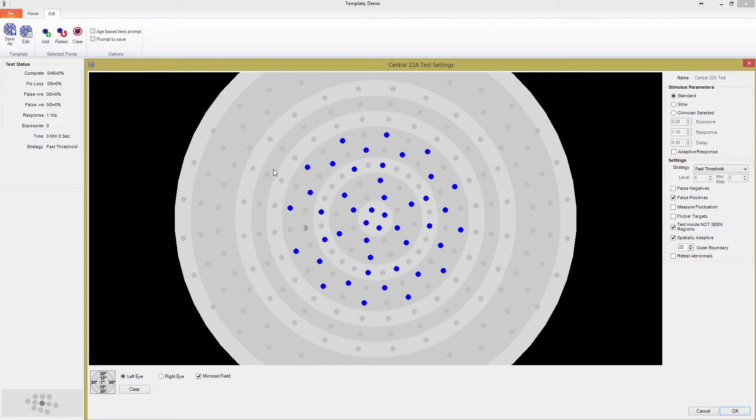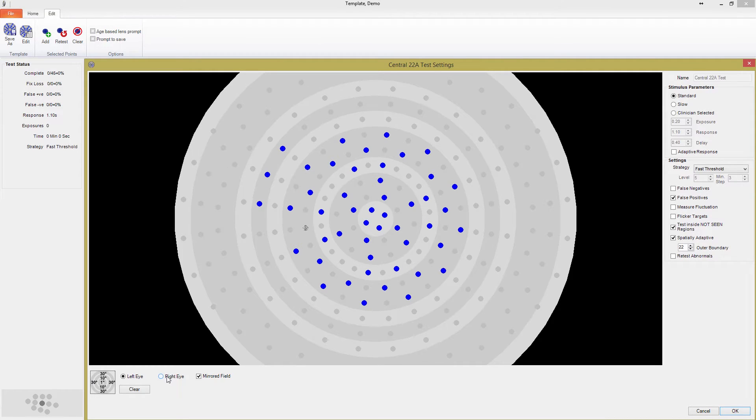For example, if I add three points in the periphery of my exam for the left eye, when I select right eye, you will see the points are mirrored across.